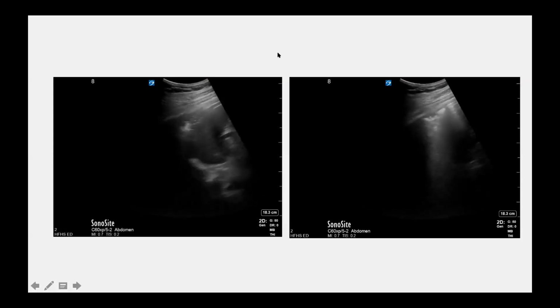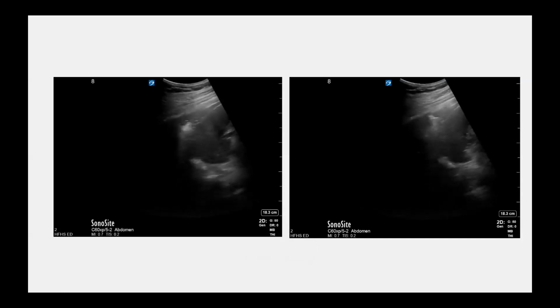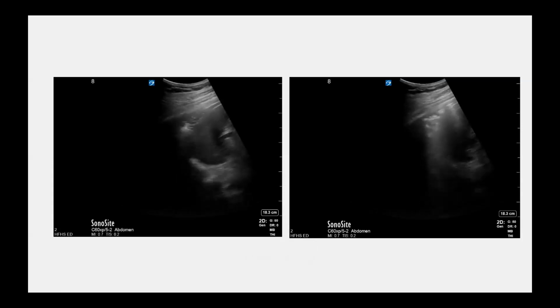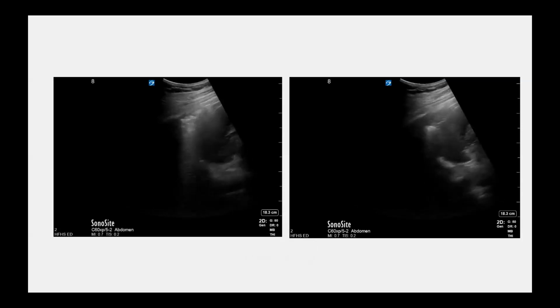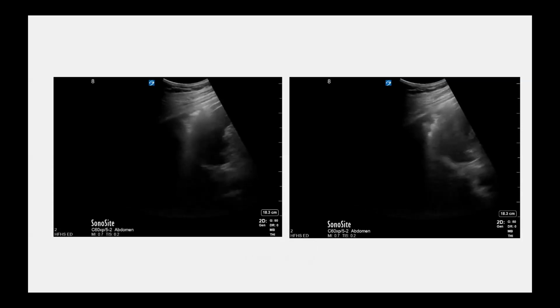It is visceral pleura, which is coming in and out, but I'm not sure about the chewed up appearance. I'm not sure what the exact terminology is. Okay, so one thing you can think about is the normal visceral pleura, we look for lung sliding, and you look for a nice uniform linear pattern with to and fro motion. So in this case, are we seeing a nice uniform linear visceral pleural line, or is it kind of shaggy and irregular? It is shaggy. Yes. It's probably that shred appearance.